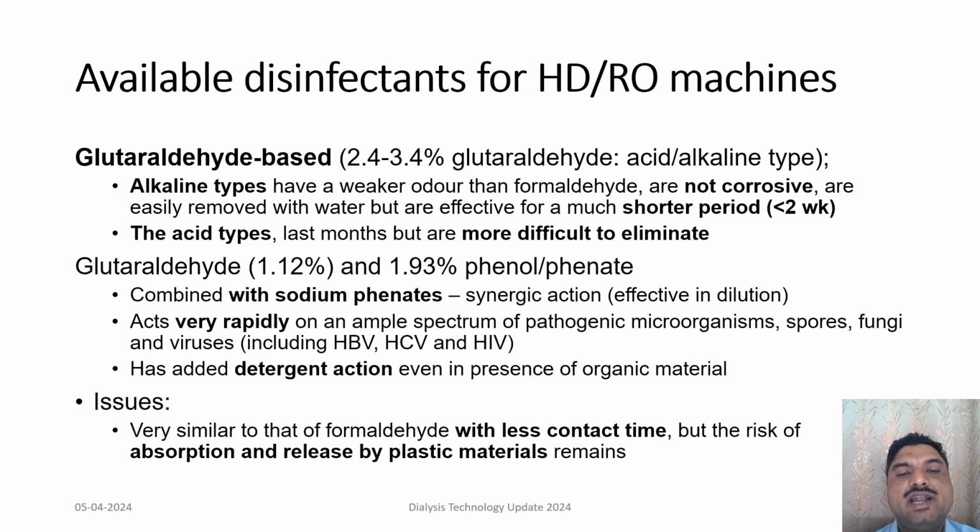But the glutaraldehyde concentration can be reduced if it is used in combination with sodium phenol or sodium phenolates in concentrations of 1.93%. They have a synergistic action, so even in dilution, glutaraldehyde can work nicely. It is found to be very rapidly active on a ample spectrum of pathogenic microorganisms, spores, fungi, and viruses, including hepatitis B, hepatitis C, and HIV.